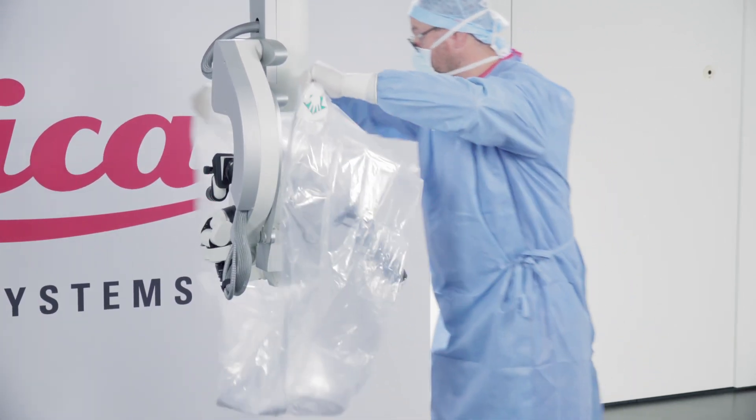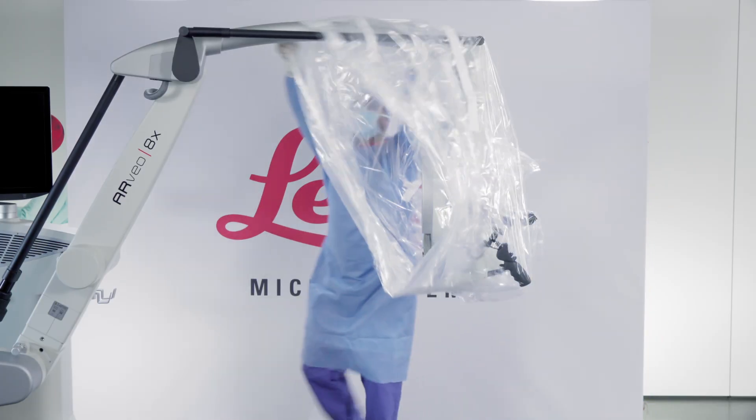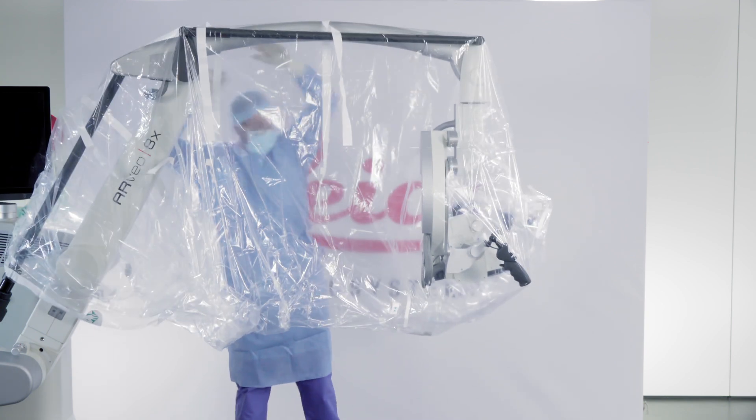Move the drape over the microscope head and pull it over the rest of the arm. Your circulator can assist you by pulling the drape from inside over the microscope arm.